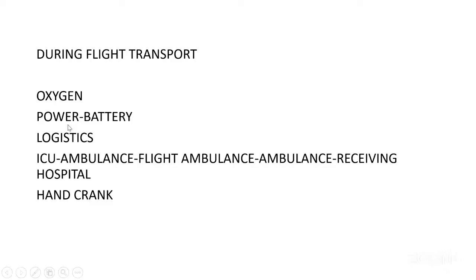The power and the battery: whether the aircraft has power to support your ECMO and ventilator, or whether your ECMO batteries will have to be used in that scenario. How much is the duration? Whether your batteries will be sufficient for that much time.